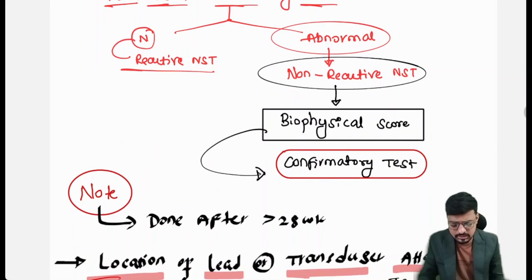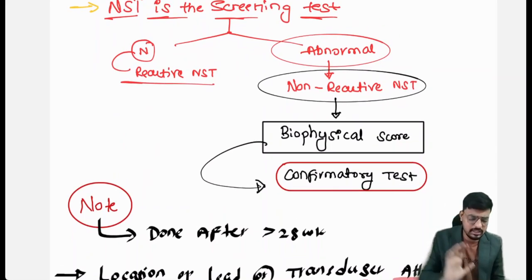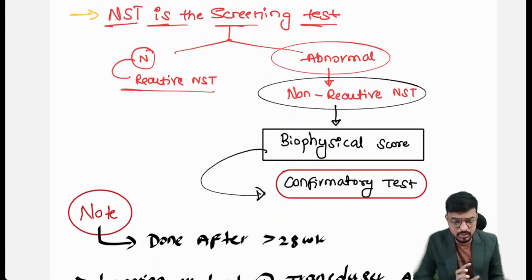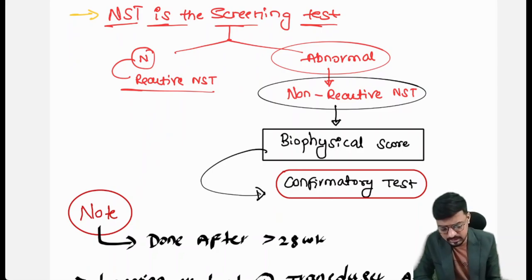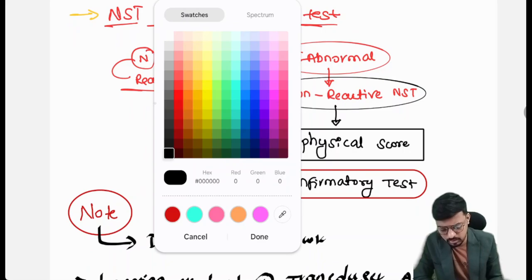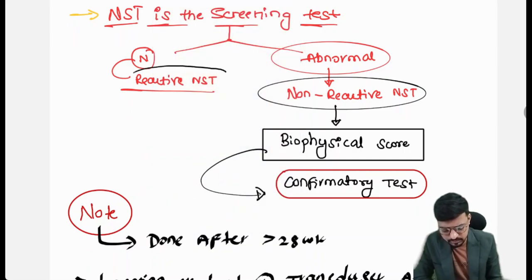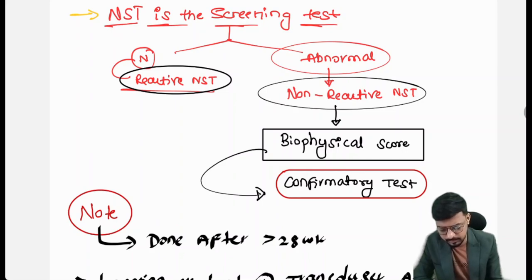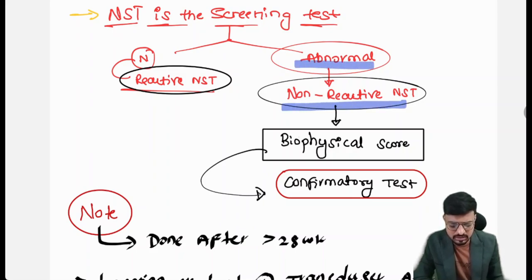The non-stress test is a screening test. It is not a final diagnostic test. If this NST comes normal, that is what we call a reactive NST. If in case this particular NST comes abnormal, that is what we call a non-reactive test.